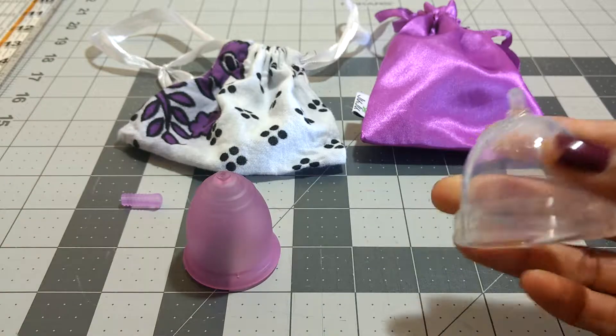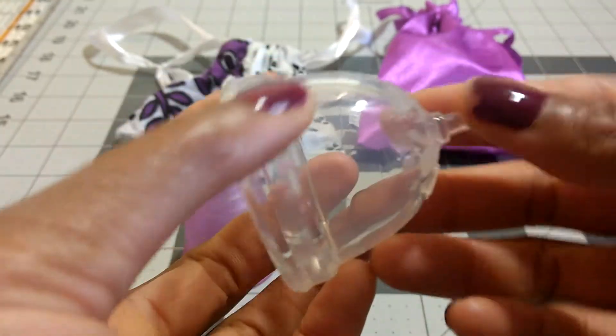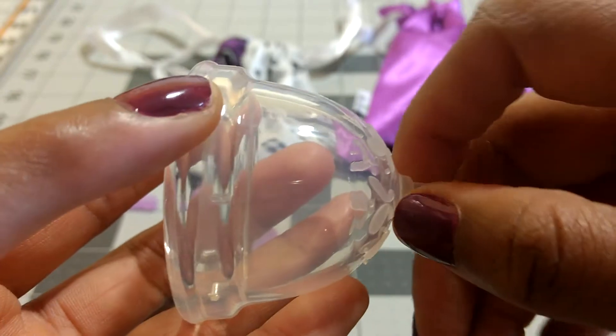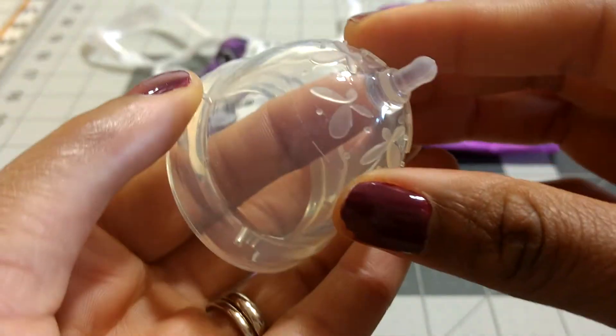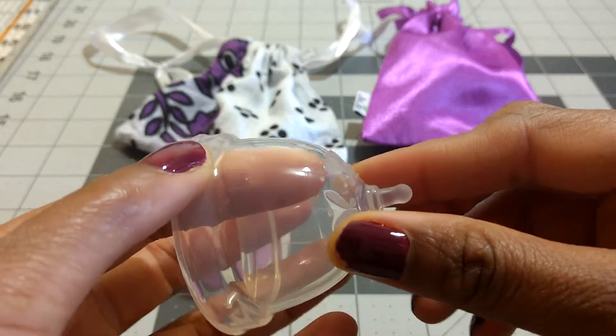I'm going to go through the Juju Cup first and show you the grip rings and the base. The Juju Cup has this short blunt stem, so I haven't had to trim it at all — it has a kind of ball at the end. There's a little ridge attaching the stem to the rest of the cup. Then you have the grip rings; in this case it's kind of a butterfly pattern that serves as a grip.